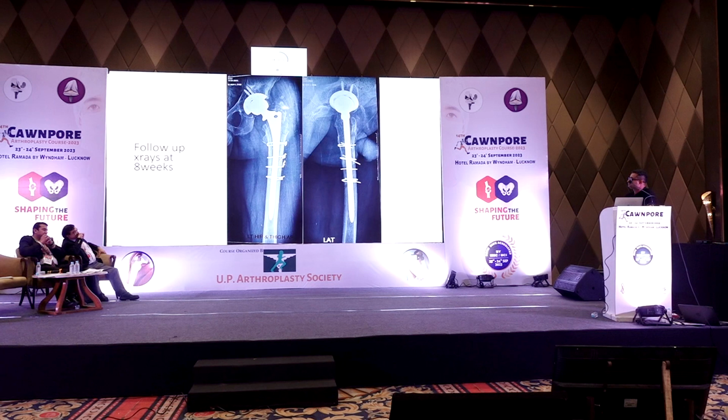No, and so if you prepare with the Wagner reamer, that is a conical reamer, you will be able to definitely fit in a Wagner 14, simply because remember it's a tapered stem. So a Wagner 14 tapers down to almost 8.7. So that easily fits in and that gives you a good fit.